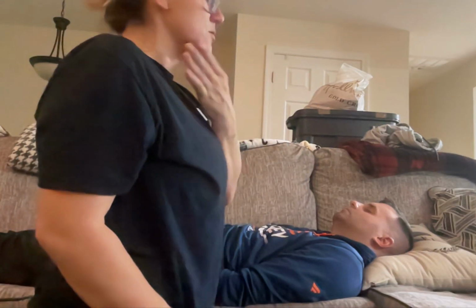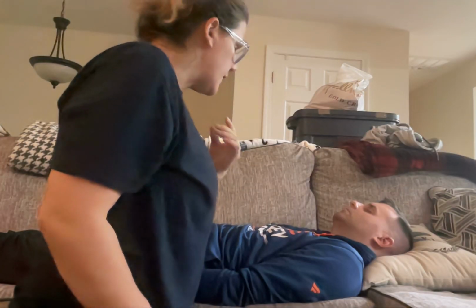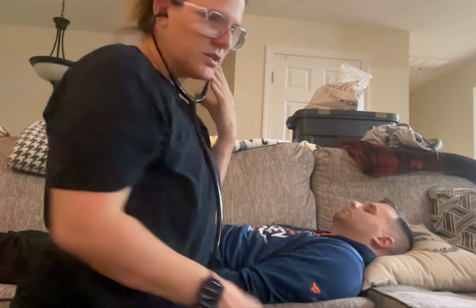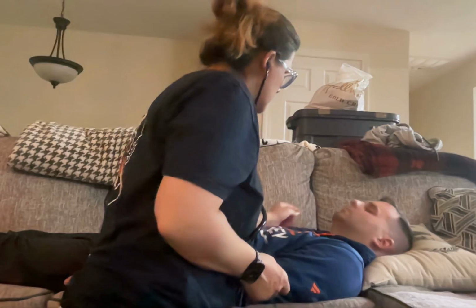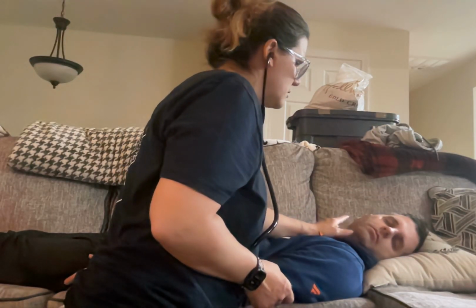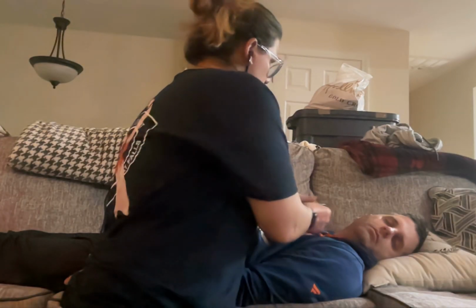Next, I'm going to palpate for the carotid, and then I'm going to auscultate as well. I'm going to do that using the bell. All right, can I have you look to the left? Take a listen.